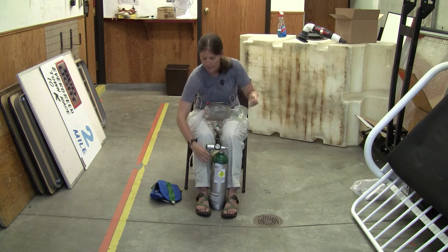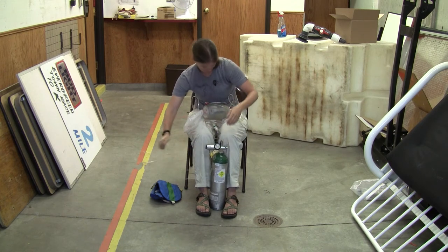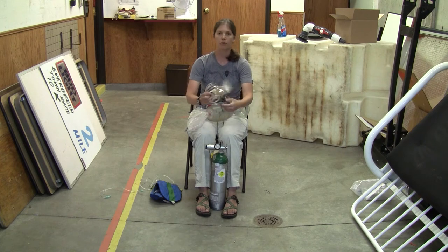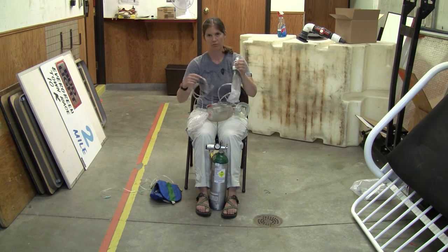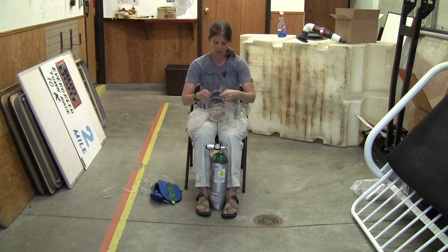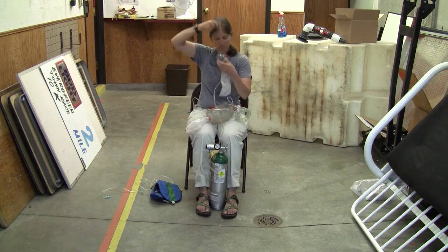The next delivery system you're likely to see is a non-rebreather mask. The flow rate for your non-rebreather is 12 to 15 liters — some references will say as low as 10 liters. It connects here on your tank and is applied to the patient like this.